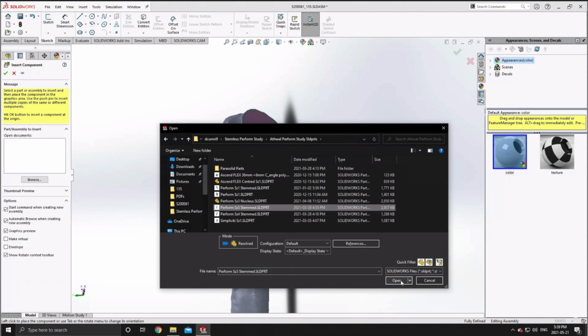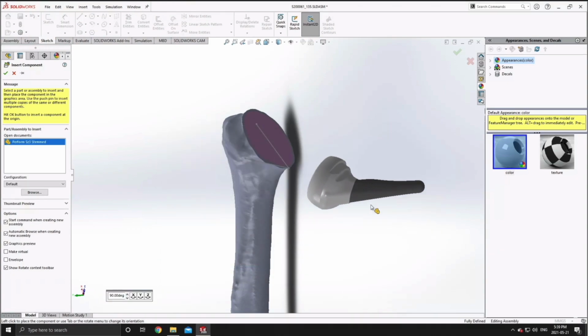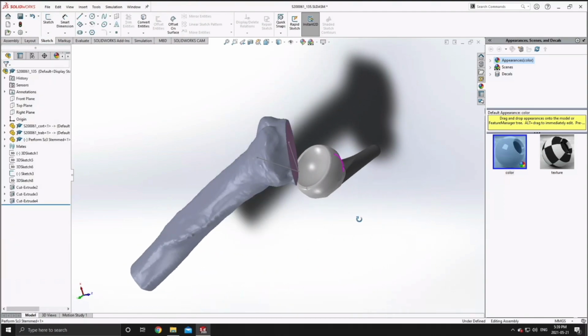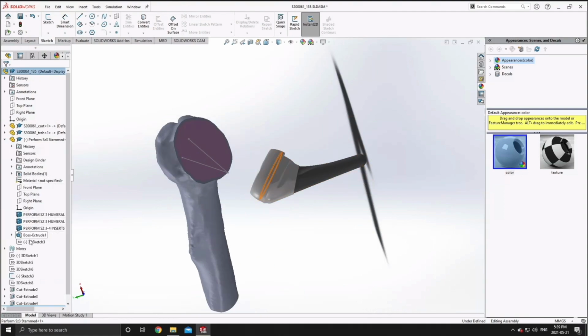But you've finally made it to the portion of the tutorial where we're actually doing the implant positioning. Now as you can see here, I'm just starting off by bringing in my SolidWorks implant model, and I'm going to be using this particular model as the master implant for all of my subsequent implant positions.